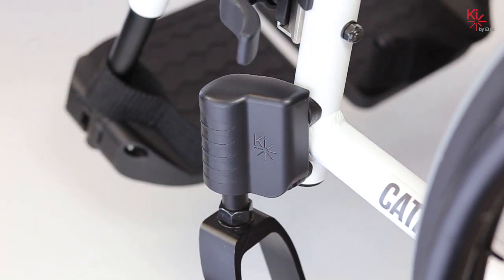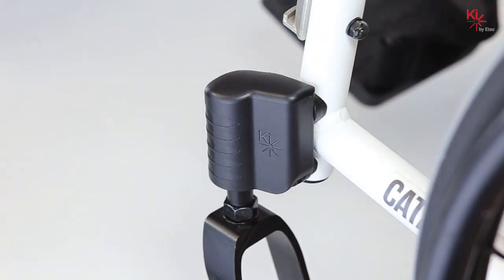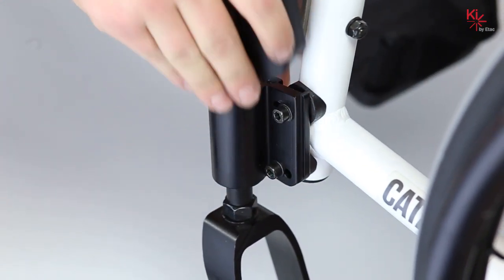The first step for ease of adjustment is to remove your footrests. Now you will want to take the protective composite cover off of the caster housing by pulling straight up.